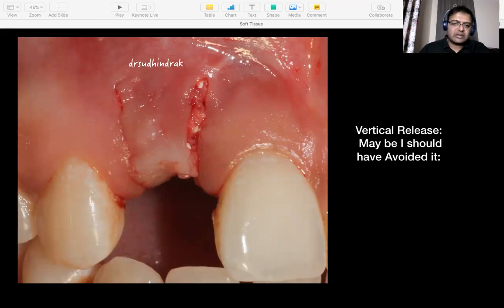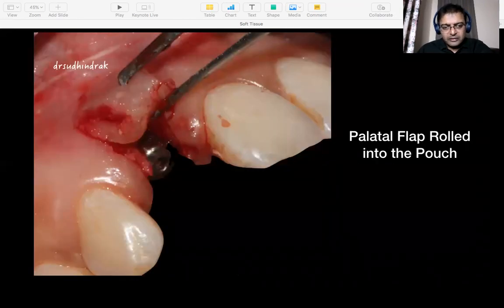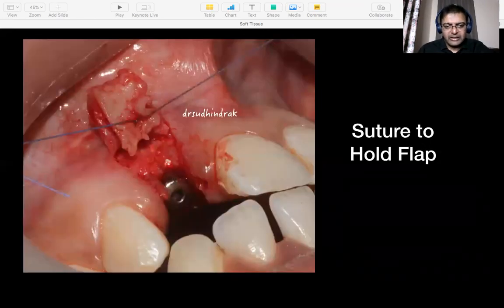Now, in retrospect, I shouldn't have done those release incisions. Release incisions are now passé. You all do an envelope roll. So I go to the palate, release out the flap, roll it. This is a classical roll technique. De-epithelialize the buccal surface, which goes in. So you have connective tissue against the implant surface and the bone. You tie it so that it's stabilized.